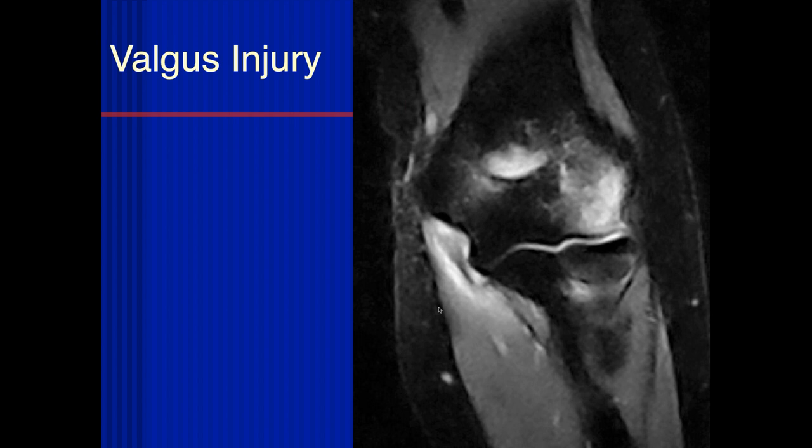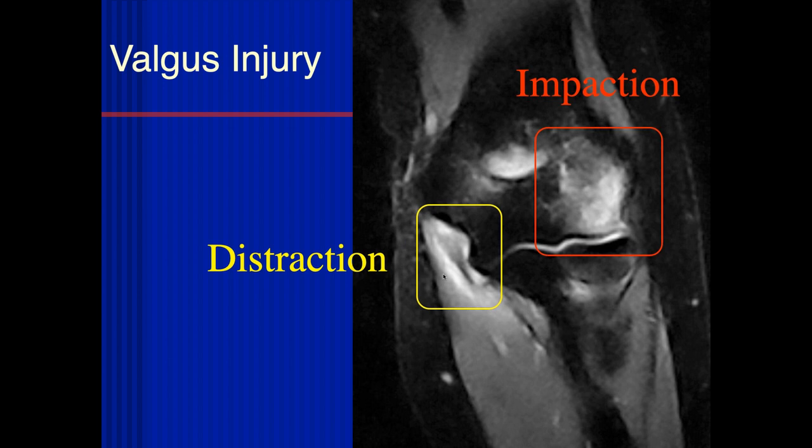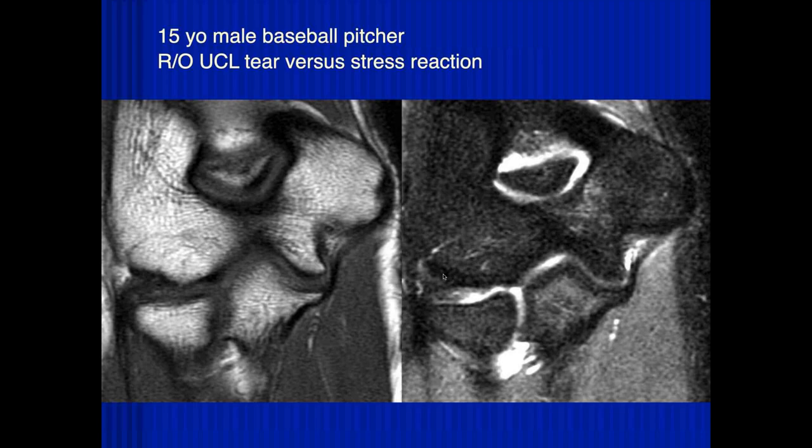On the medial side, it looks like there's some tearing of the common flexor tendon. This is the ulnar collateral ligament — it looks torn. We have a lot of increased signal with a lot of edema around it, so you might also have an injury to the tendon and muscle as well. That's impaction, that's a distraction injury, and this is more of an acute valgus injury to the elbow.